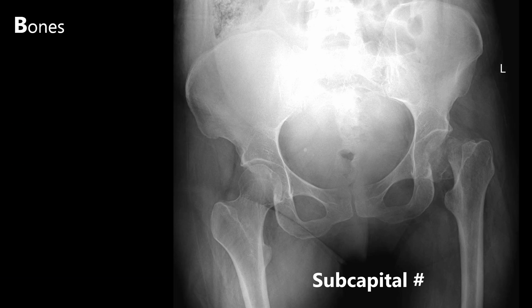This patient has a left-sided subcapital fracture, which is a type of intracapsular fracture. It's Garden type 4, so is completely displaced. Displaced neck of femur fractures like this one will usually cause the leg to appear shortened and externally rotated. This femoral head will need to be replaced. Notice the asymmetry between the femoral necks and also the disruption to Shenton's line on the left. Neck of femur fractures are typically associated with elderly patients who have osteoporotic bones and can be the result of a seemingly low impact fall.